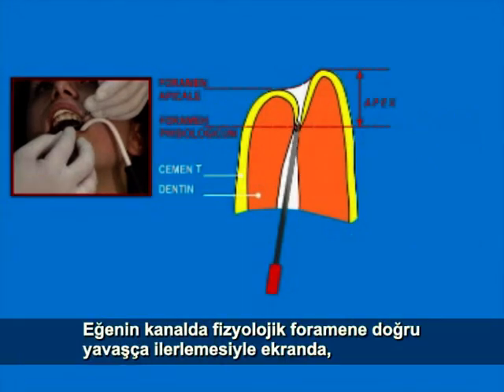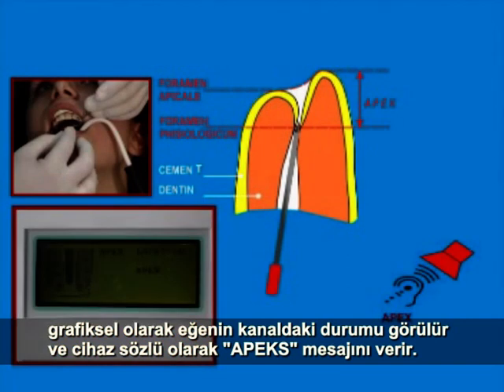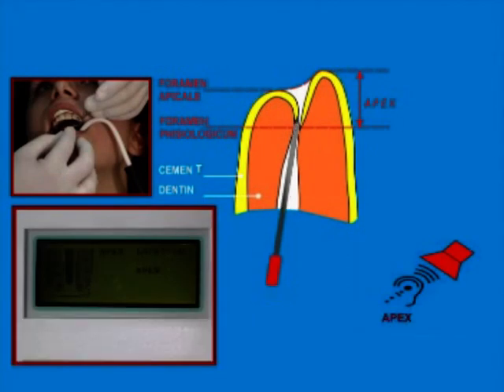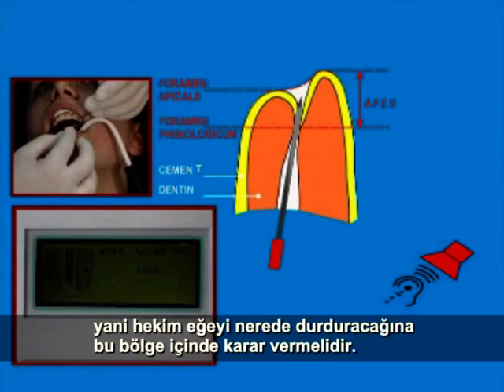On slowly inserting the file in the canal, at the foramen physiologicum, a graph of the penetration of the tip in the canal is shown on the display. The device generates a speech message to the dentist, Apex. Caution! The device generates the message Apex in the entire zone between foramen physiologicum and foramen apicale, so it is the dentist who defines where to stop inserting the file.